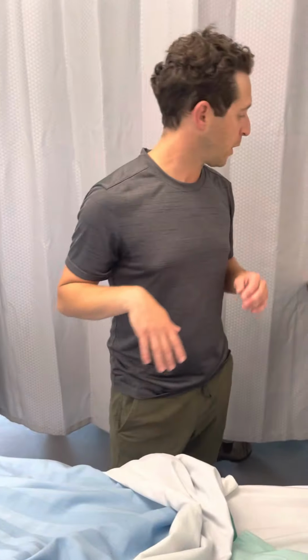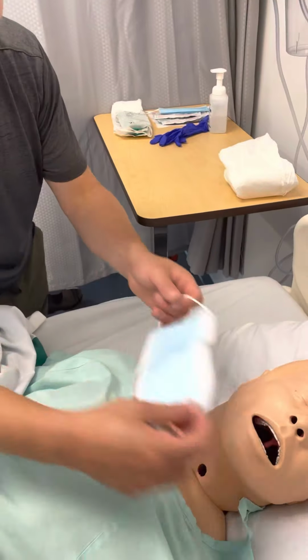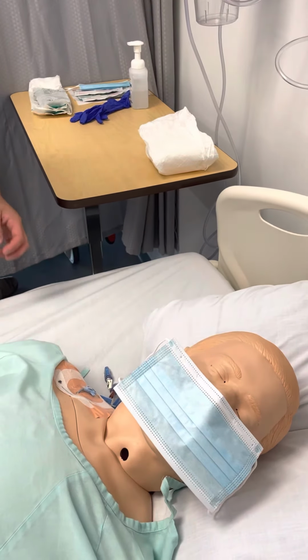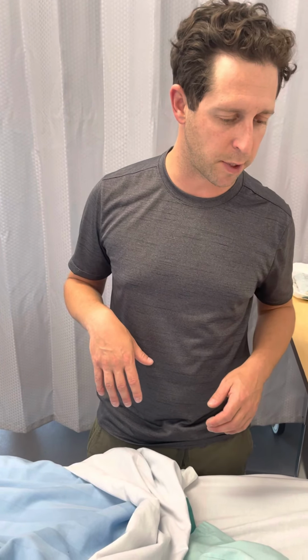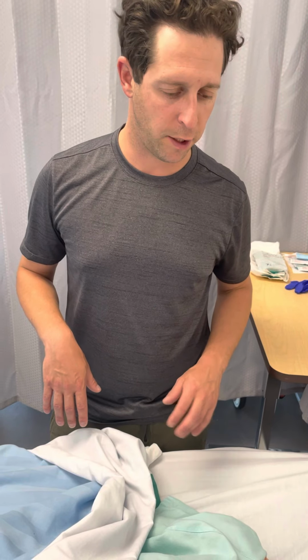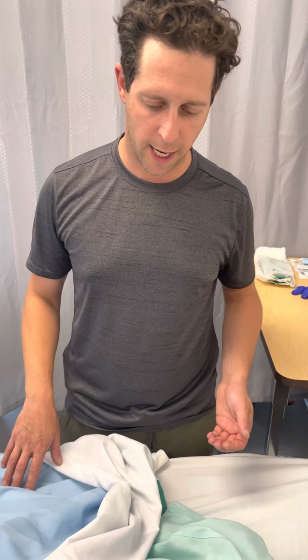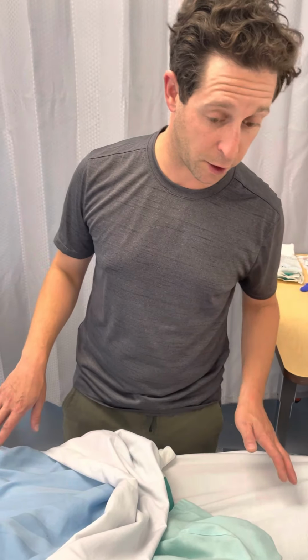Okay. Pat, I'm going to put a mask on myself and a mask on you. You're able to tolerate that? Okay, so this takes about 10-15 minutes. You have to lie on your back like this. Are you okay lying in this position flat for about 10-15 minutes? Yeah? Do you need to use the washroom? Are you in any pain? Good. And are you warm enough?